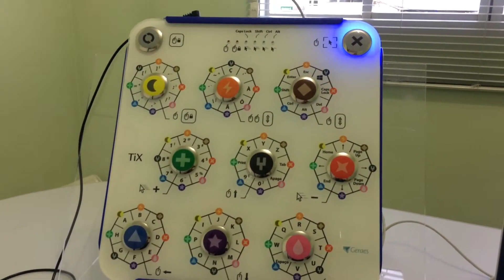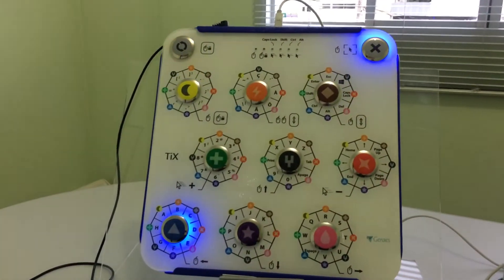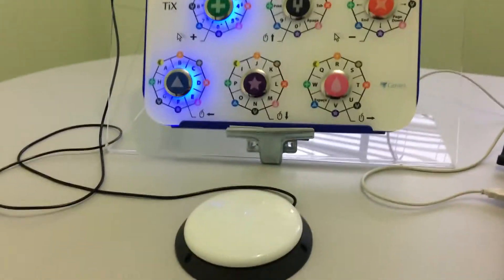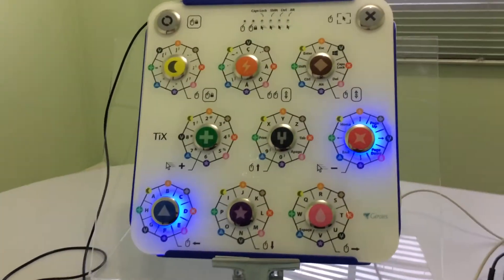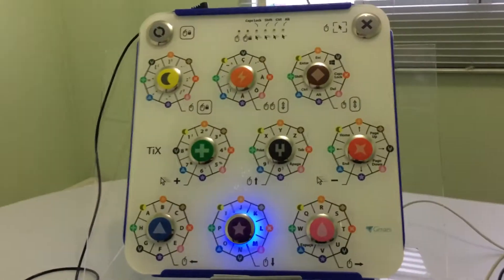For example, to type letter A, I need to press the blue button followed by the yellow button. So, when the blue button is lit, I press the button switch and afterwards, when the yellow button is lit, I'm going to do the same thing. By doing so, I've typed letter A on the screen.